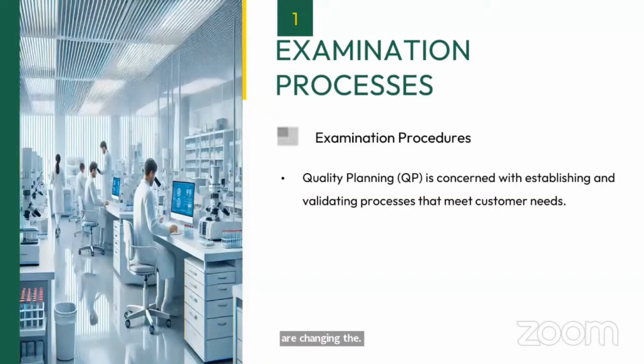Now, same for GOD-POD estimation of blood glucose, I am going to incubate for 15 minutes. It is the routine protocol. Most of the time we are following 15 minutes. Now, over the period of time with my experience, what I have found out is that even if I incubate it only for 10 minutes, it should give the correct result.